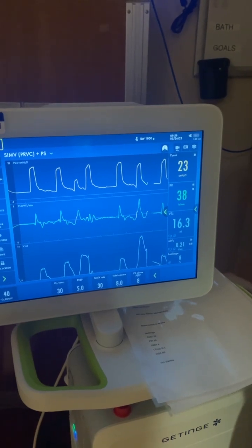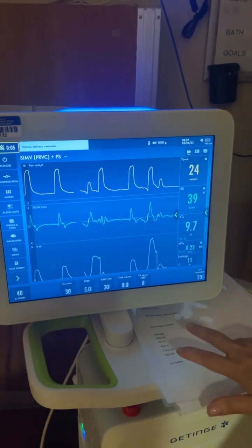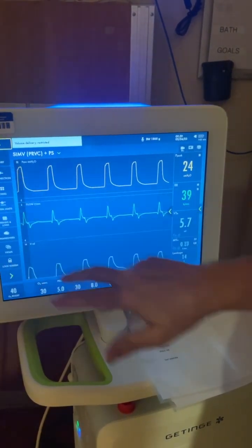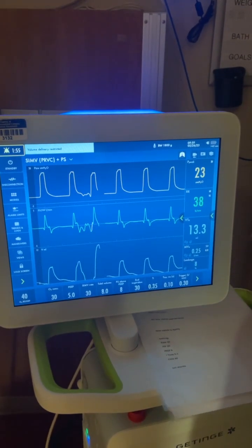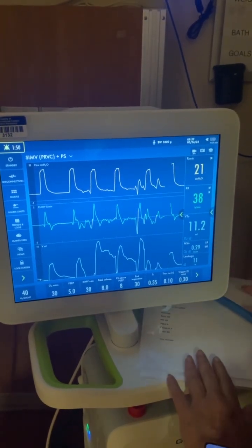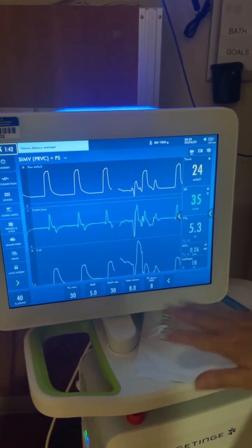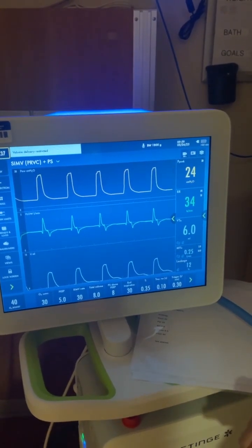Okay. And then as far as what you need to know as a bedside nurse, your vent settings. Back in the old version of our Servo, you had to go into a second page to get your vent settings. This is only an alarm because my lung is only so big, and that's the only reason it's saying my volume's being restricted. So now, if you can't see all your vent settings, you're like, hey, what's my I time? I need to chart that. There you go. Now you can see everything and you know what to chart.